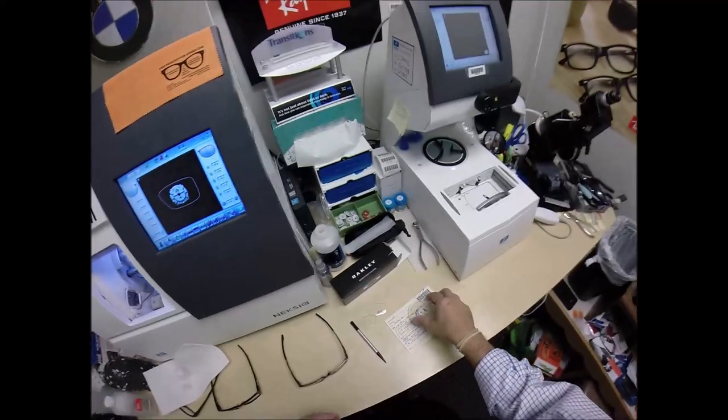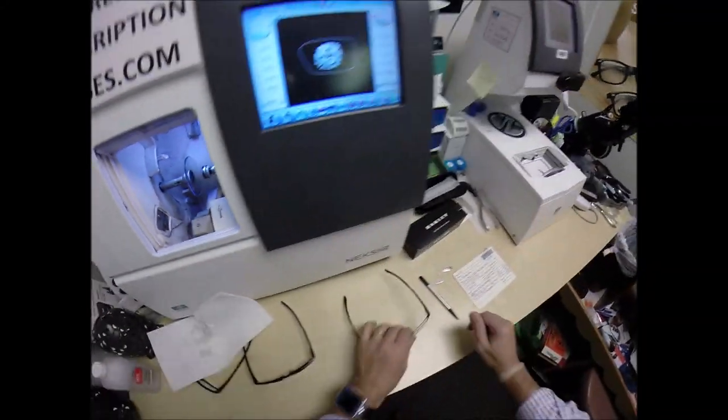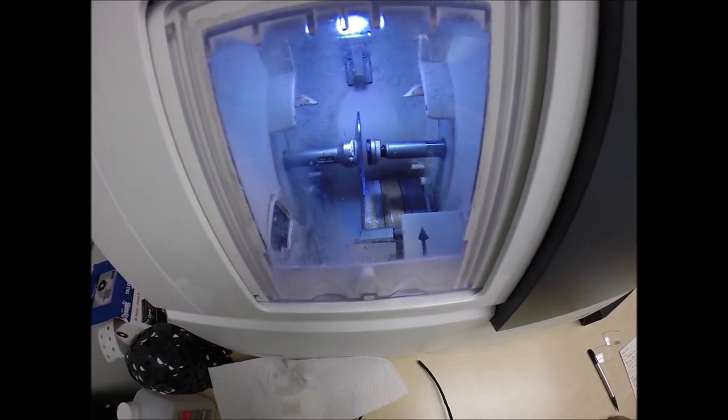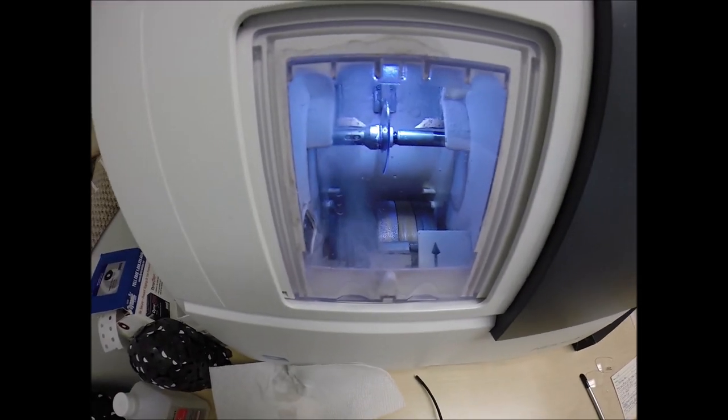So let's flip that over to L. L, the magnet goes into the Charles, the Chucky baby, the Charles, or tonight I'm calling it the Leif. Hit the green start button. The door closes, the clamp shuts. The lens is going to be traced again by the same two white styluses, making sure that it's large enough to fit into the left side of the frame.